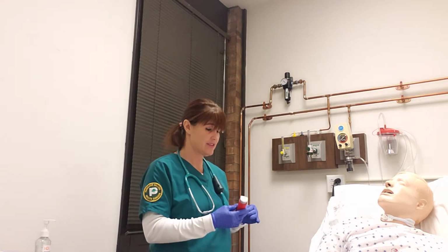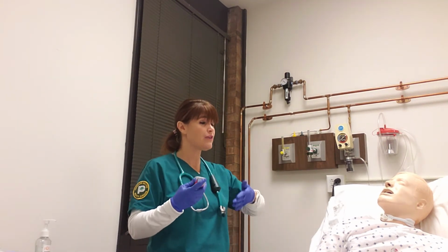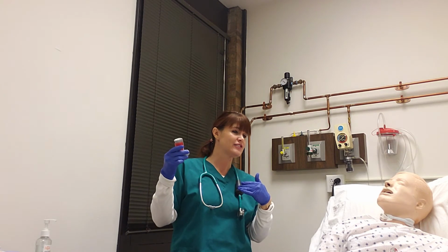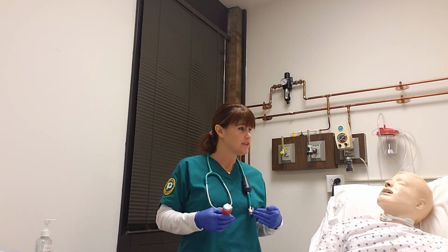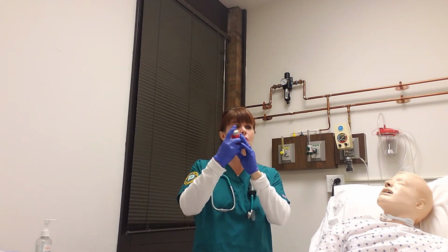Now the way you take this dose is you're going to want to shake it, and you're going to spray it into your mouth while you have airflow. And what I mean by that is you don't want to spray first, because then it's going to land on your tongue, and you don't want to do it real quick at the same time. It may just hit the back of your throat. We really need to get these in your lower airways. So you're going to want to shake it, put your lips around it, bam.